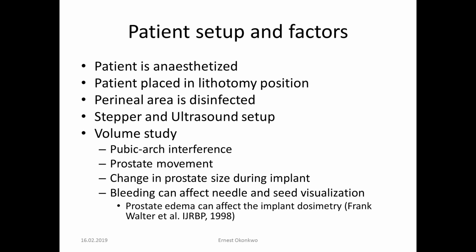Patient setup and factors. Of course, the patient is anesthetized. The patient is placed in the lithotomy position. The perineal area is disinfected. The stepper and ultrasound are set up. You want to make sure that people are not walking around, because you might have colleagues walking around, and you want to make sure that the cables are out of the way, and that your notebook or your TPS is getting current all the time.